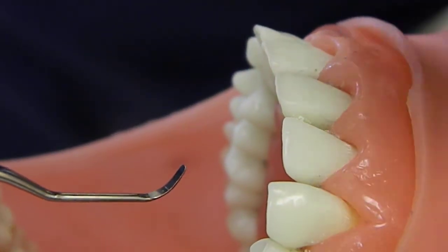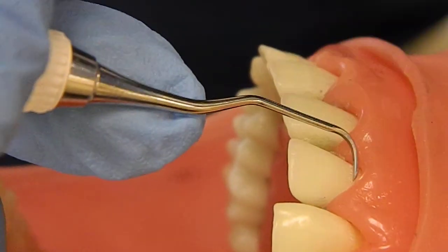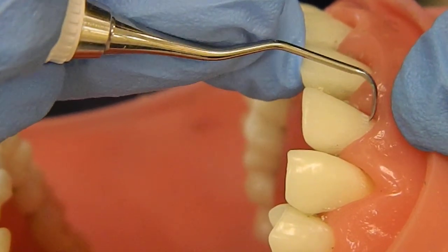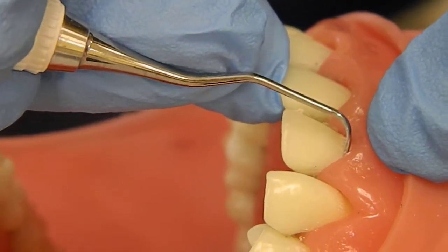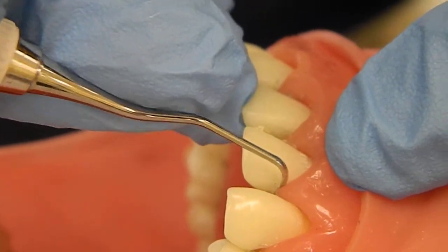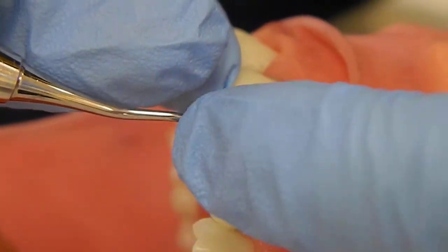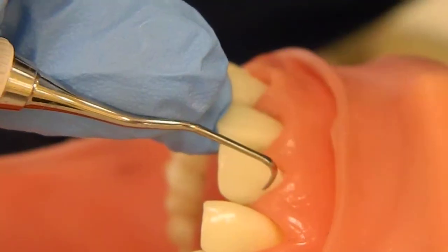For the away surfaces, this blade is going to easily apply to the away surface. Starting on the toe and turning to the side, overlapping the midline. You can feel the instrument biting into the tooth as you go. Then we go subgingivally, blanching that tissue, and walking straight into the interproximal surface — because we don't want that extra tilt toward the tooth since it's already at a 70-degree angle.